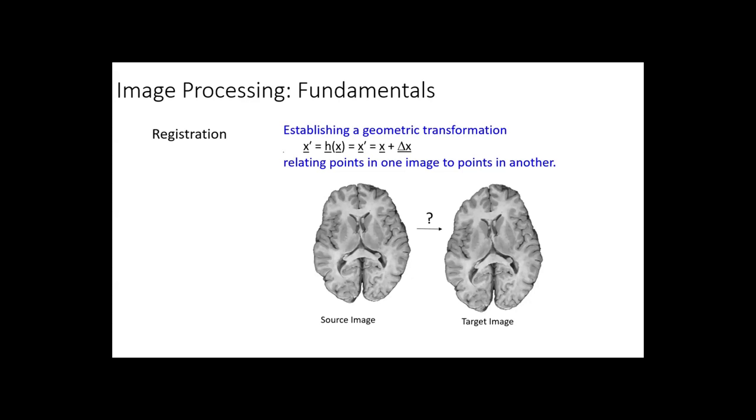They correspond to each other. So basically the input is two images, and we want to estimate a deformation field. For each point x, y, z here, we're going to estimate a deformation dx, dy, and dz, so x plus dx, y plus dy, and z plus dz. We're going to find the correspondence.